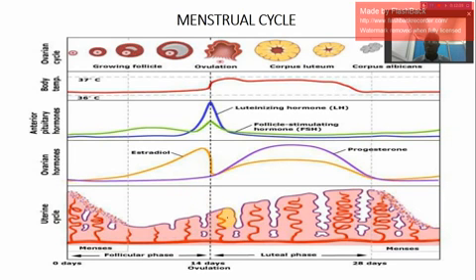This is the endometrium you are seeing here. It's sloughed off. When it's sloughed off, it comes out as menstrual blood, menstruation. These are the spiral arteries you are seeing supplying blood to the endometrium. The spiral arteries come from the arcuate artery. You can see the arcuate artery running at the base, in the myometrium. So this is the myometrium, filled with the arteries feeding the endometrium with blood.